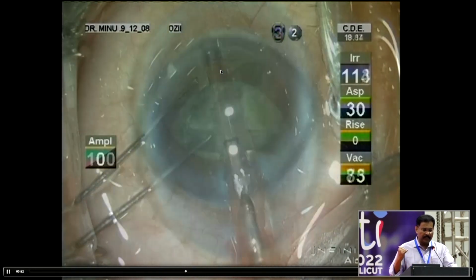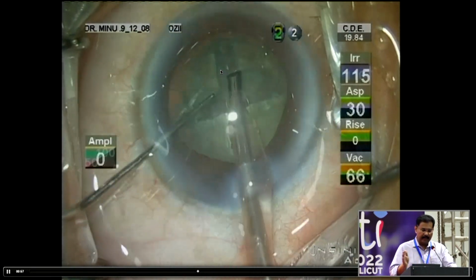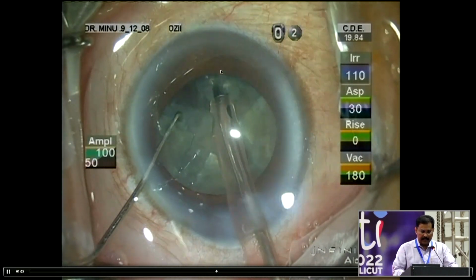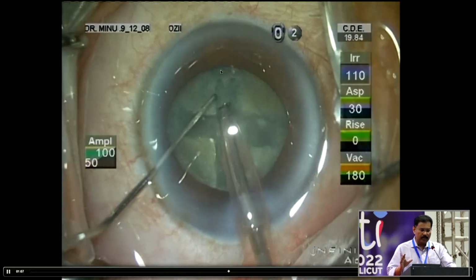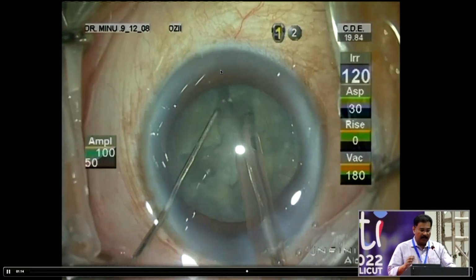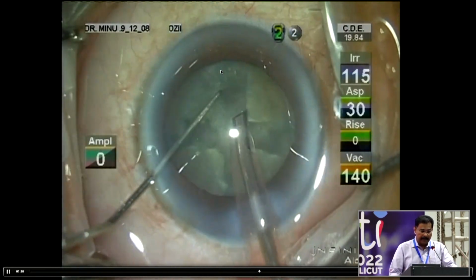This kind of occlusion should not be there. The tip mostly should not get occluded. So once you have that, you can use either the same instruments inside the chamber with just irrigation, no aspiration actually required, or stop, put viscoelastic, use two other instruments from paracentesis and split. Split should happen at the base of the trench, not superficially, otherwise it will just open out like this without the base splitting. So make sure it splits.